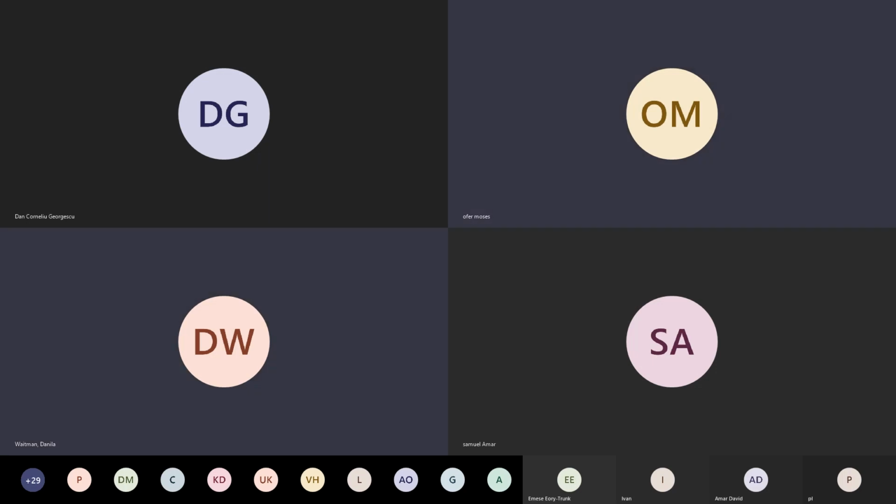Case of buccal lamina fracture, can you fixate it with a suture? No, it's not enough to use only the suture. You have to fixate the bone. But it's not a problem. Either you use a fixating screw or an orthodontic wire. Dr. Morar, I'm not acquainted with the Nash burrs.